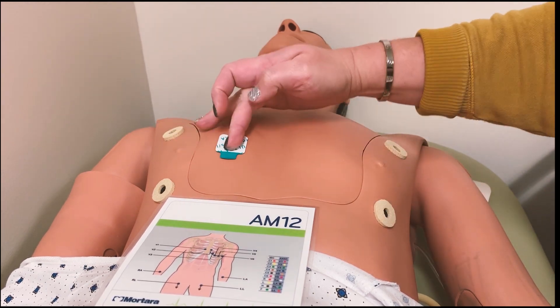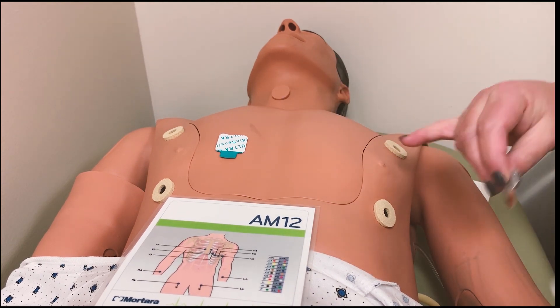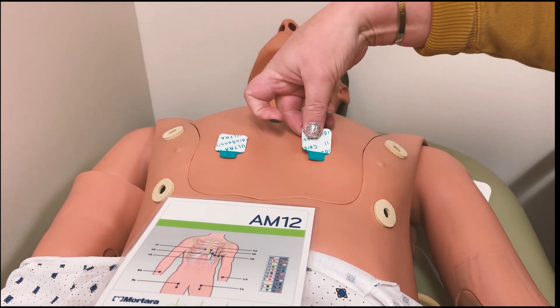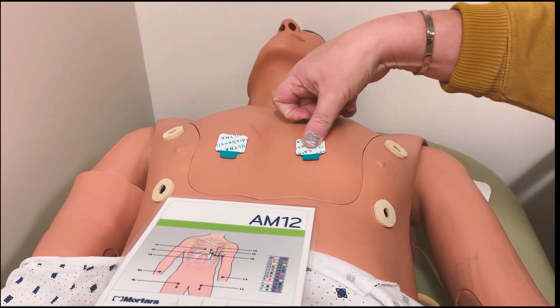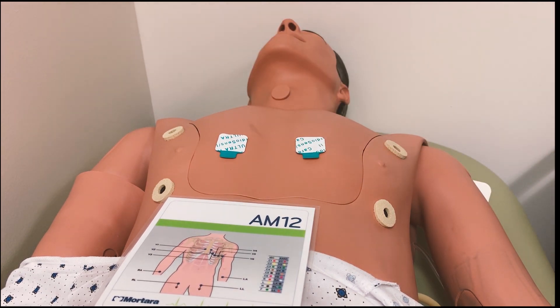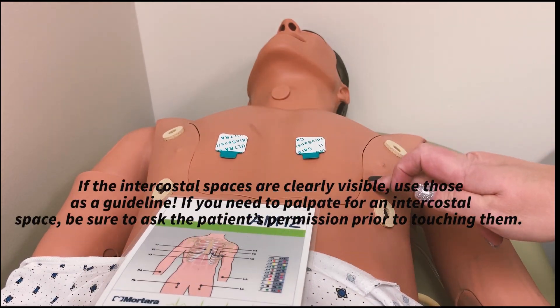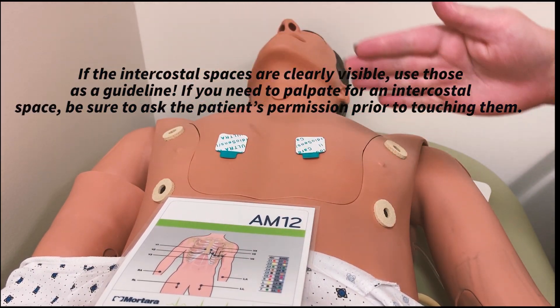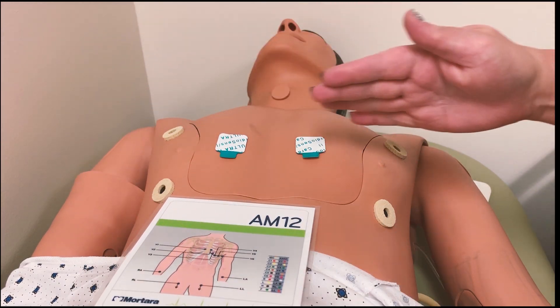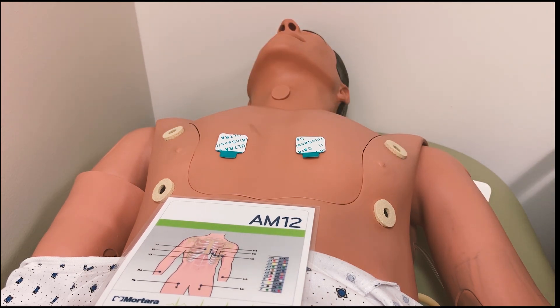V2 is going to go directly across from V1 on the other side of the sternum. Again, I usually go about mid-nipple line — don't touch people's nipples, it's weird. That's about the fourth intercostal space. It's sometimes hard and painful to be pushing down on people's intercostal spaces, so especially for males, I typically just use an imaginary line about nipple line to put V1 and V2.